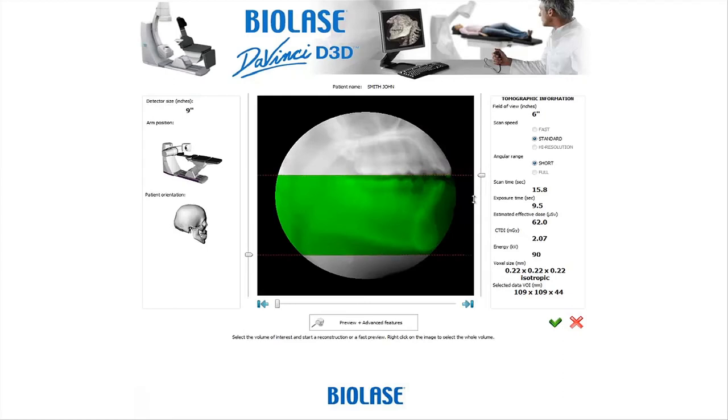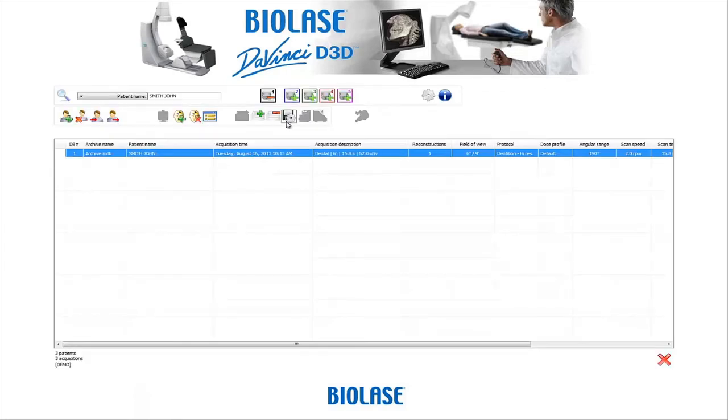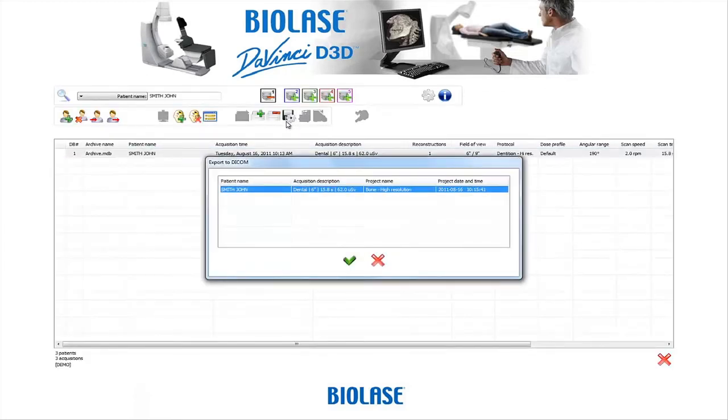Once the images are captured, they can be exported into a variety of software platforms for advanced analysis. The standard DICOM 3.0 files facilitate easy transfer to programs such as Anatomage.